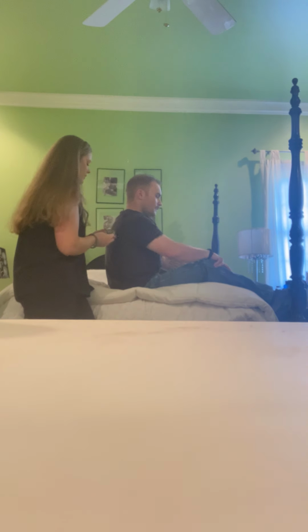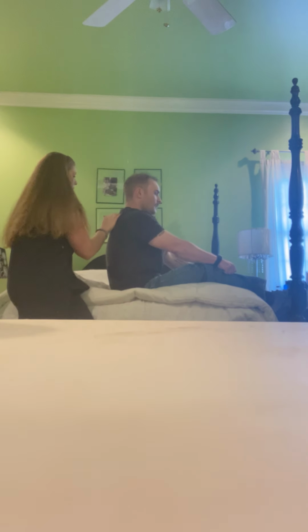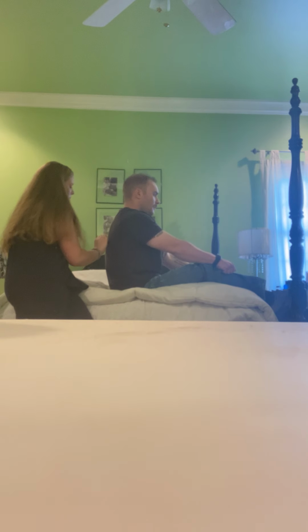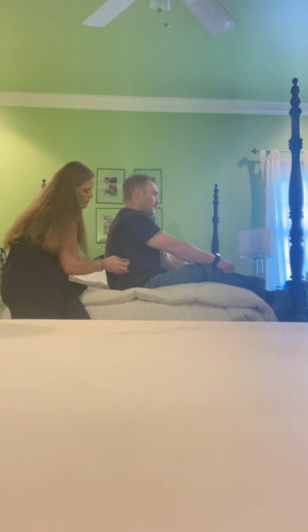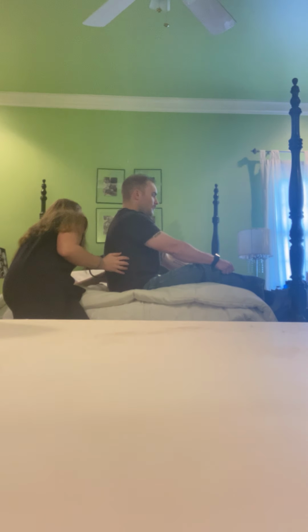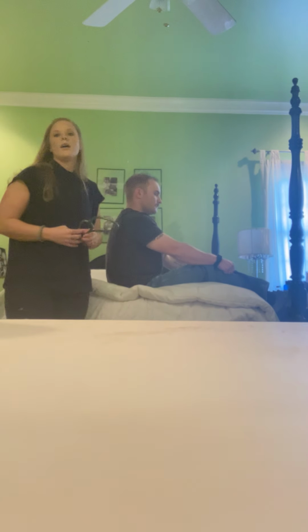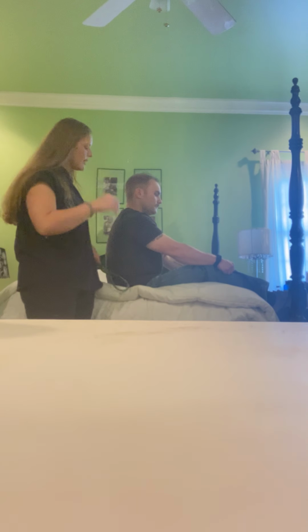Alright, I'm just going to have you take a few deep breaths, and then we'll be listening with the diaphragm of the stethoscope. And we have normal breath sounds in all lung fields. There's no signs of any adventitious breath sounds.